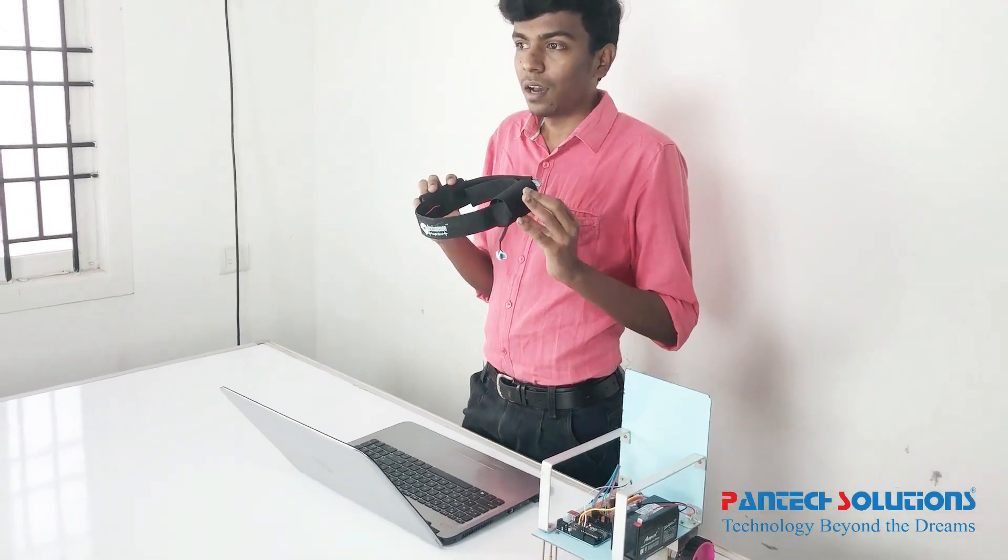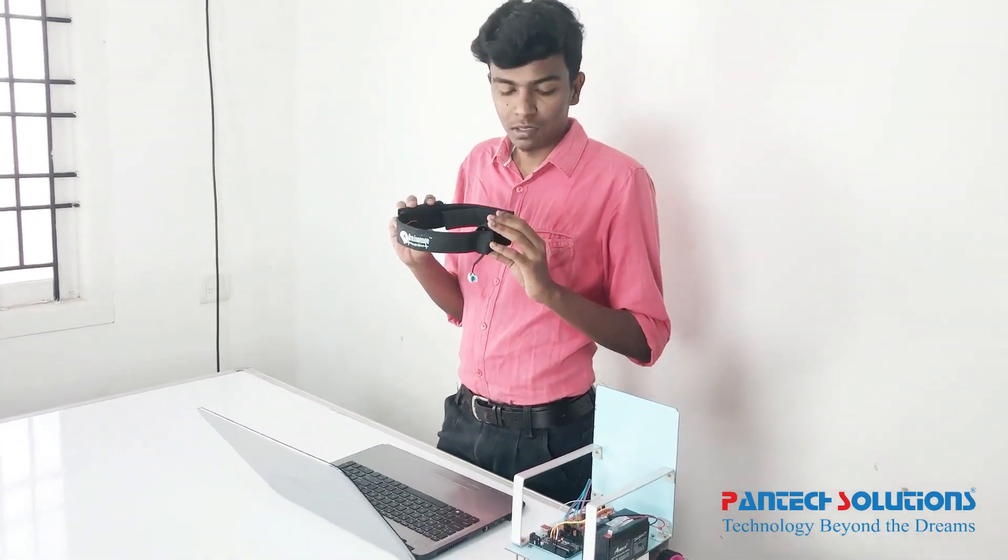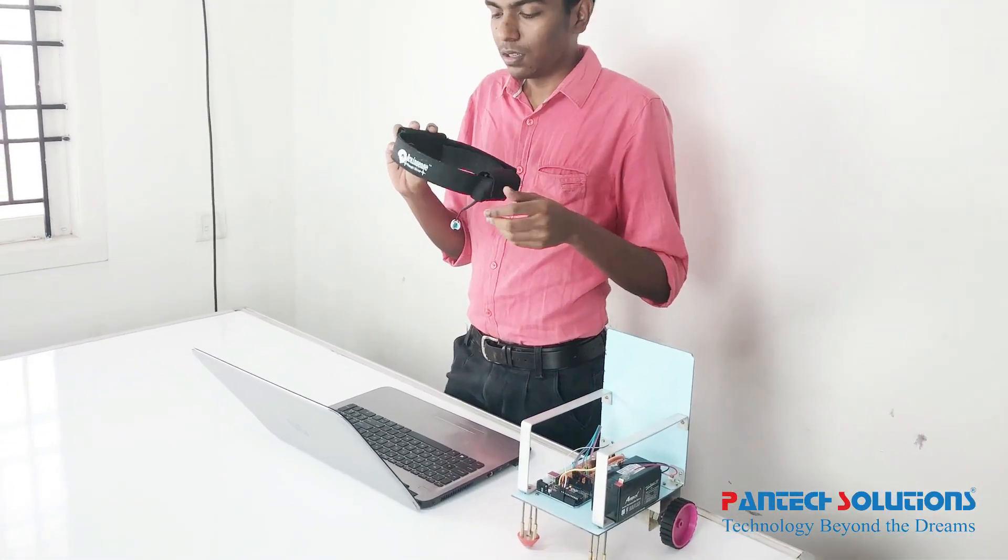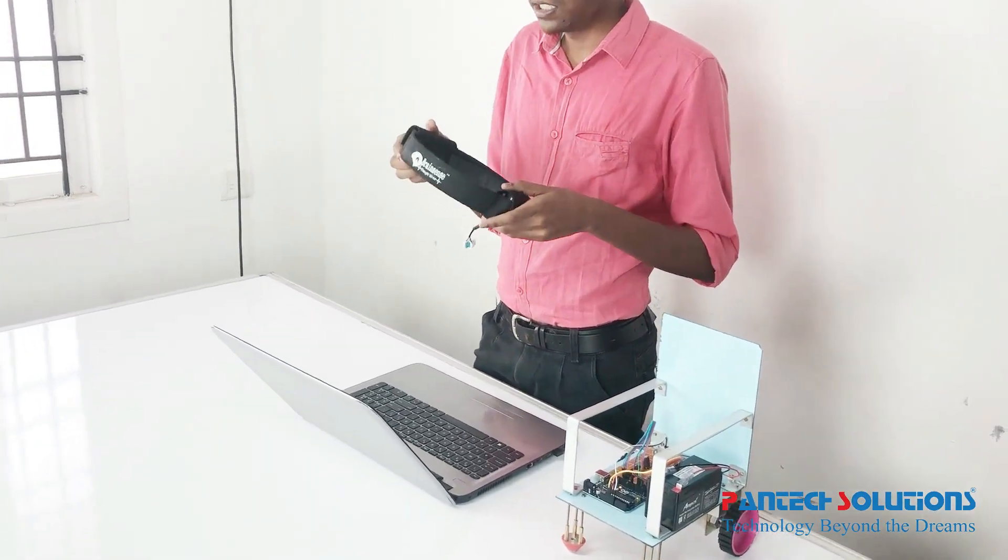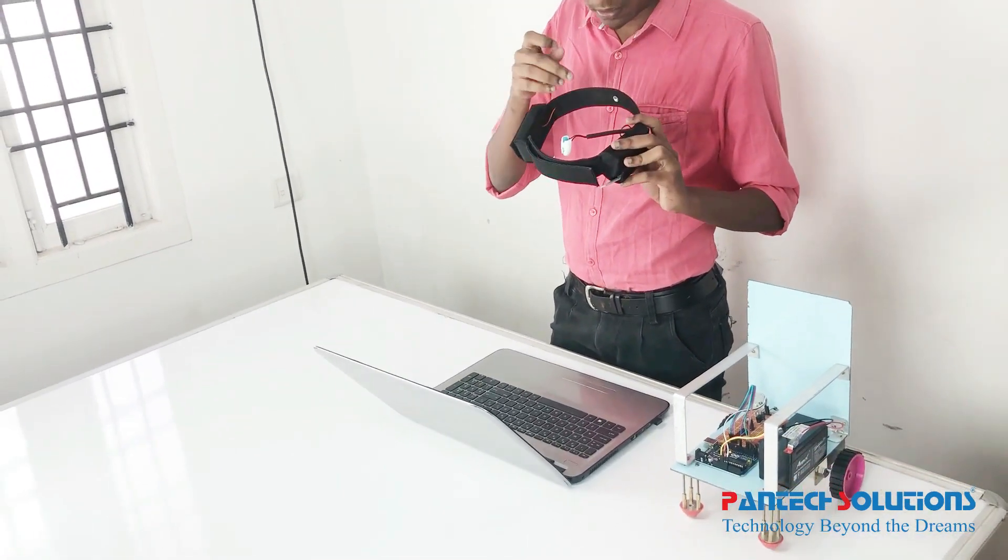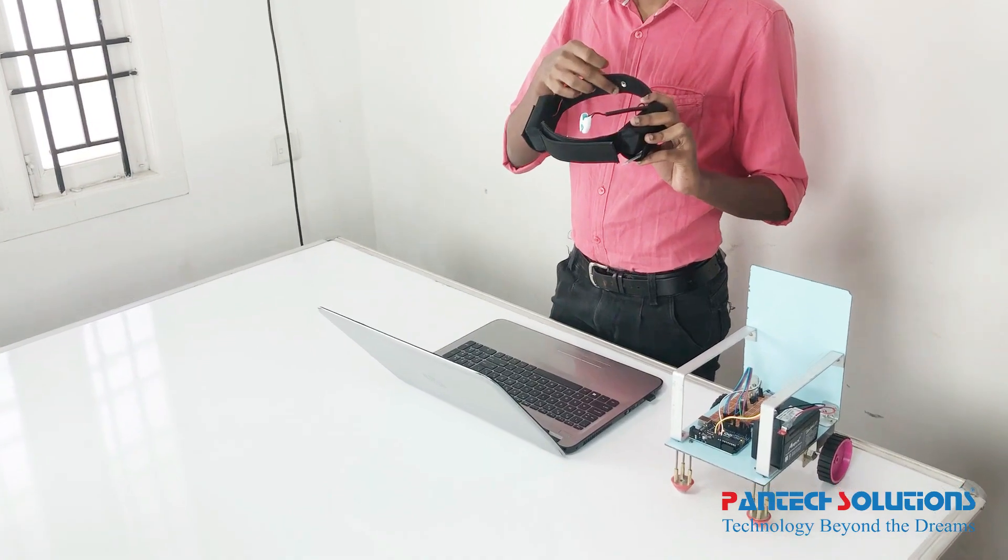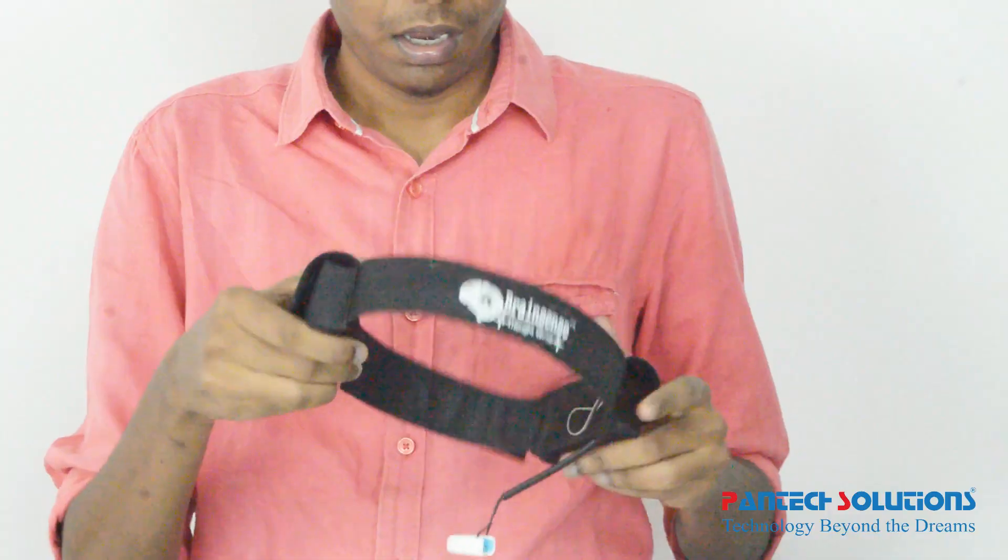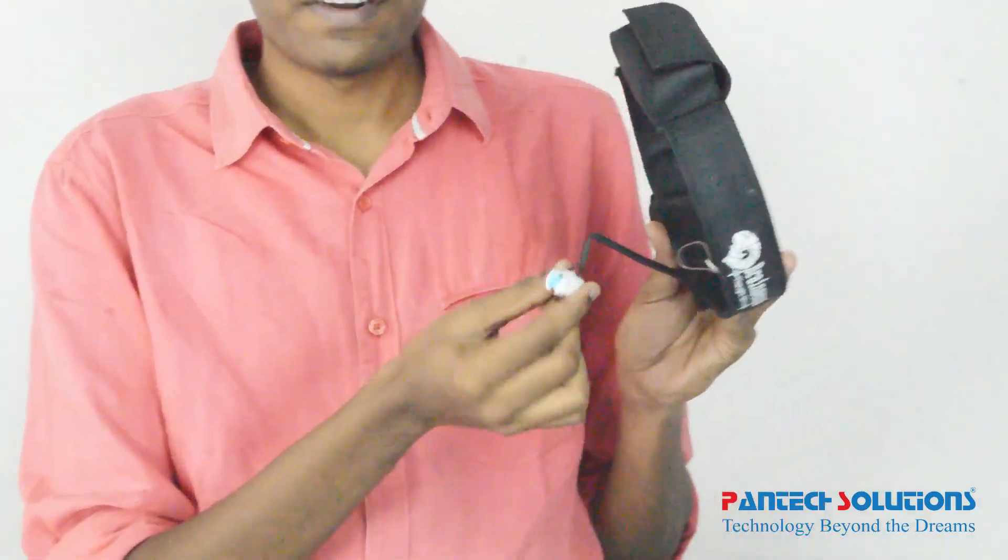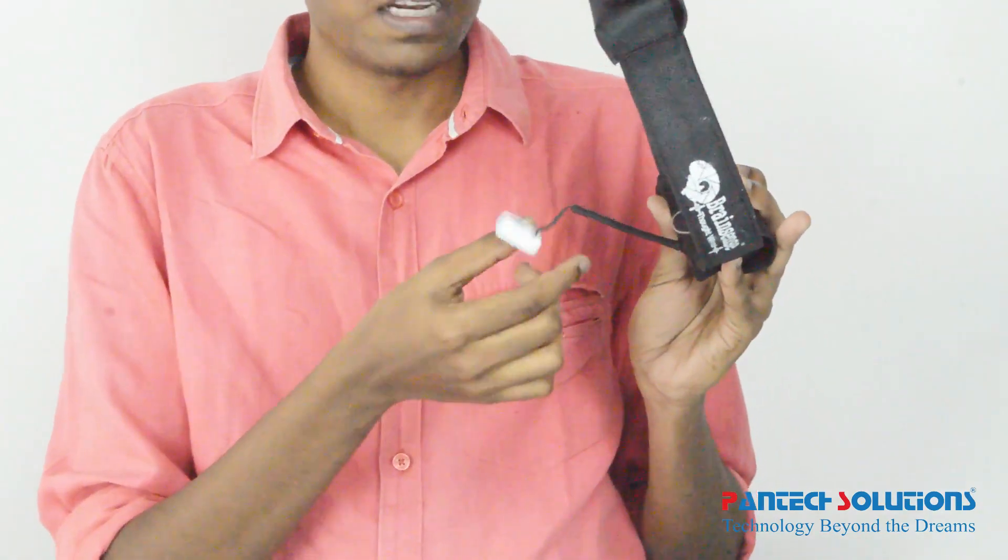By using this device, I am going to extract my brain wave to control this miniature wheelchair. This is BrainSense, an EEG machine which contains two electrodes. One is a main electrode which will be placed on my forehead. This one is a reference electrode which will be clipped to my ear.